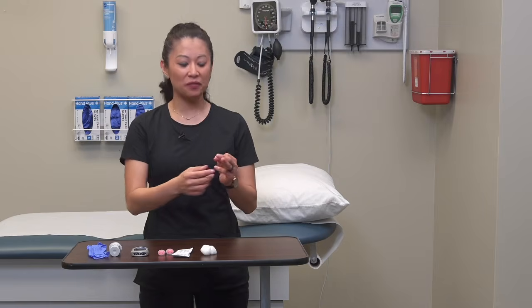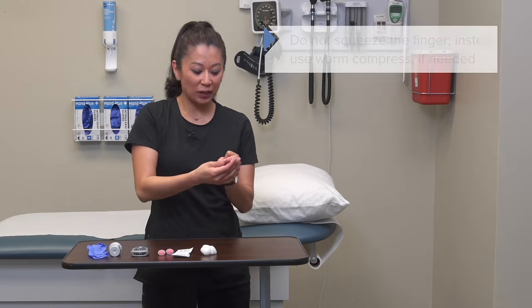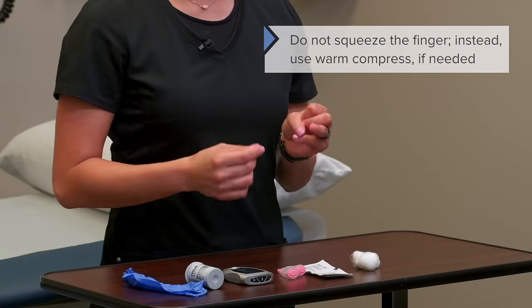So once we've identified our puncture site here, what we don't want to do is sit here and squeeze on our patient's finger.